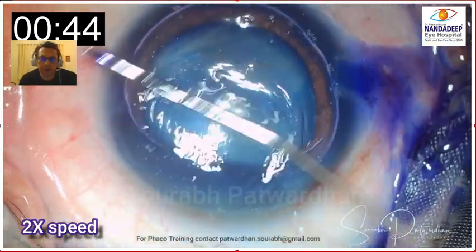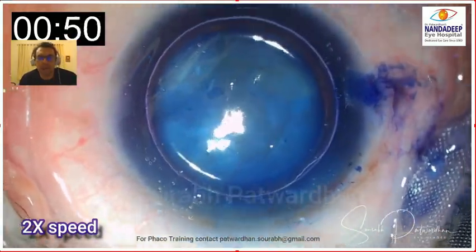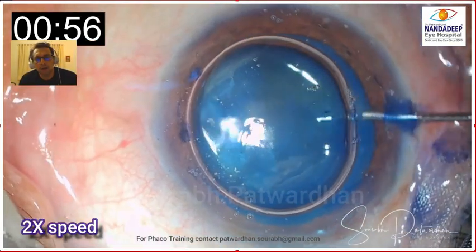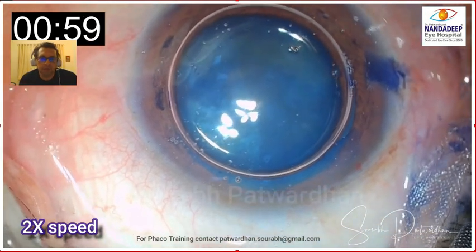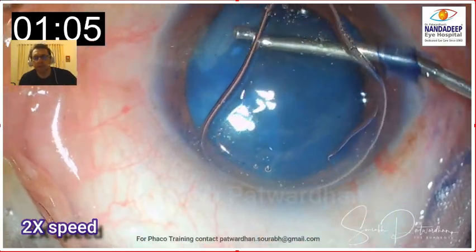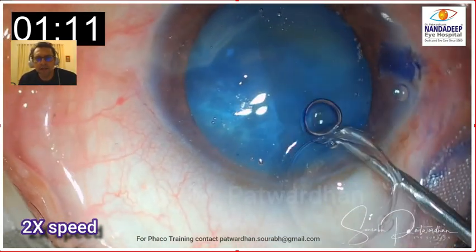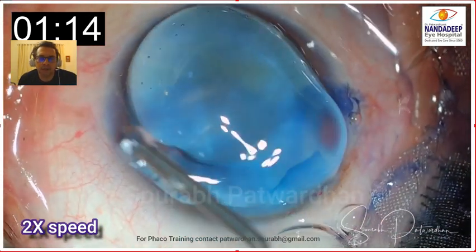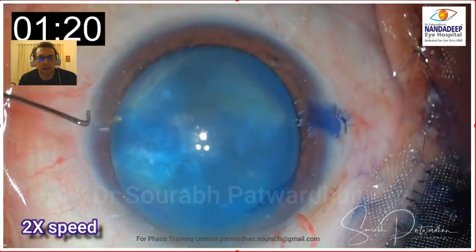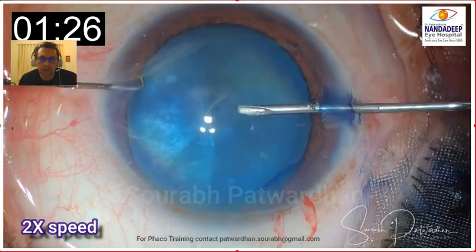I think staining was perfect. If you stain white cataracts well, it definitely helps in visualization. It also makes the capsule a little bit brittle. You don't necessarily have to press over the cornea as the surgeon was doing. The surgeon was trying to uniformly spread the trypan blue over the anterior capsule. Staining under air is a good idea because the dye gets concentrated over the capsule and also avoids endothelial damage.